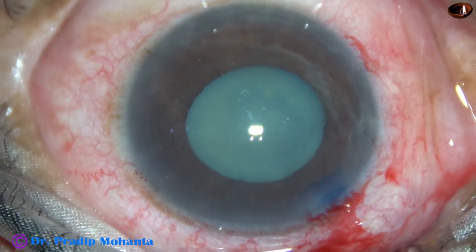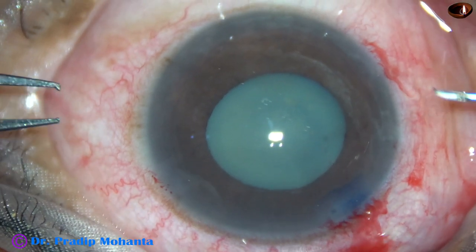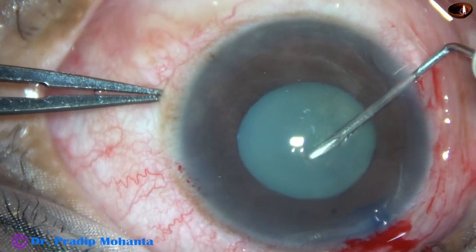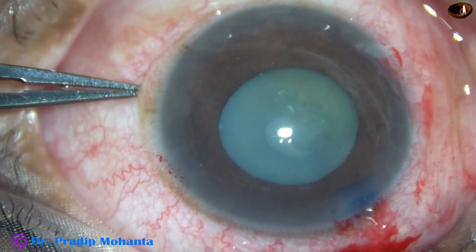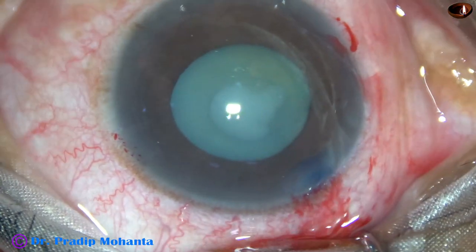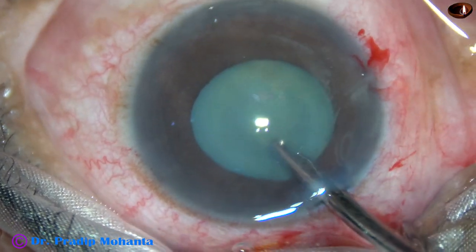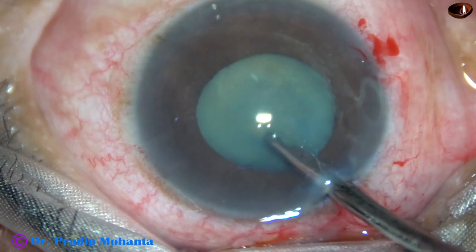Now a 26-gauge bent needle cystitome is taken. The needle is introduced through the right side port and the anterior capsule is incised. At this time we can judge zonular strength — in this case, zonules appear okay. Some milky fluid has come out and is aspirated.